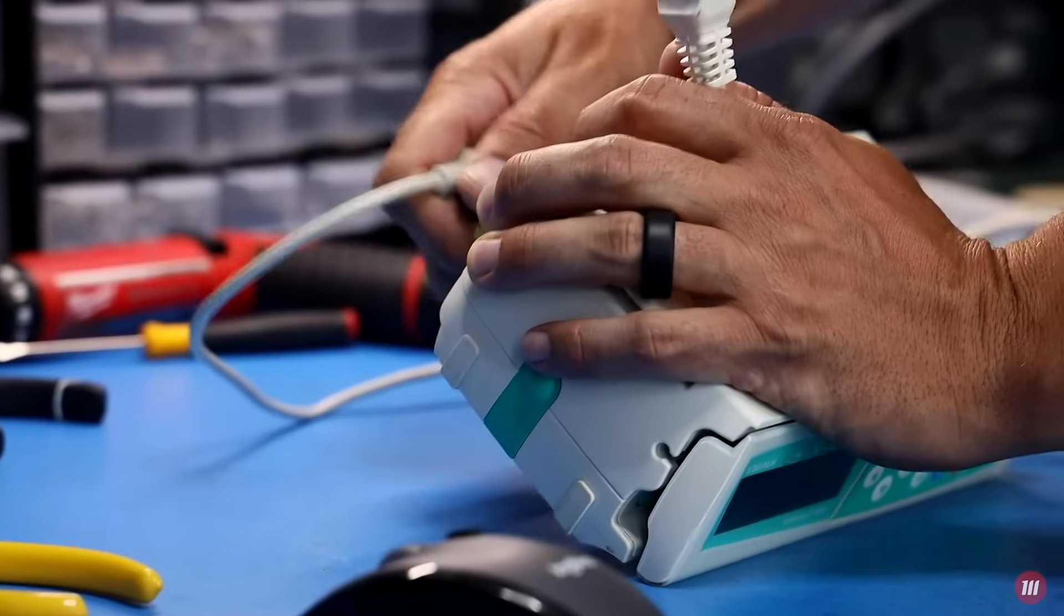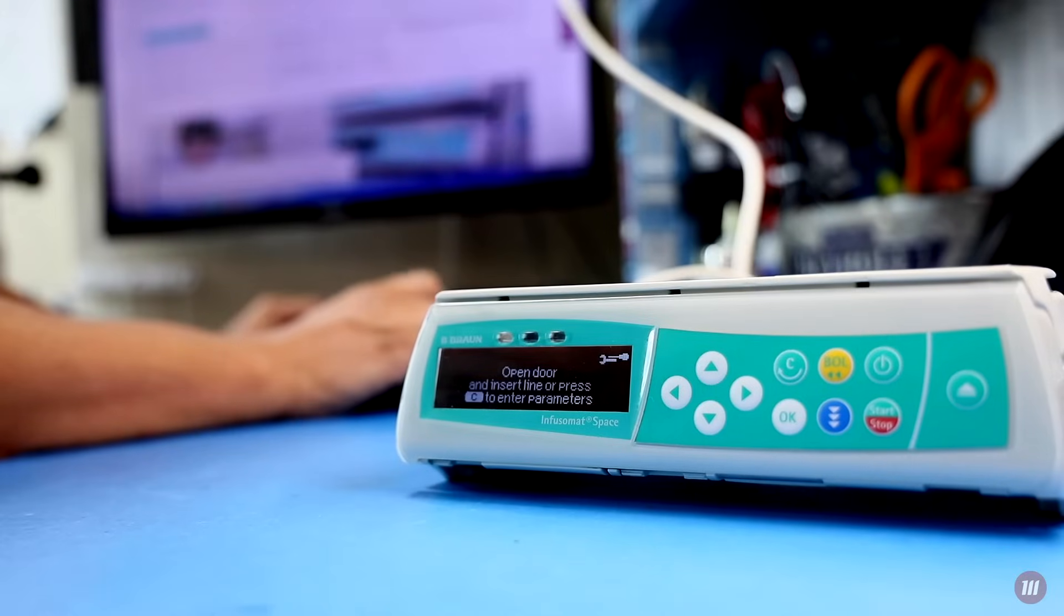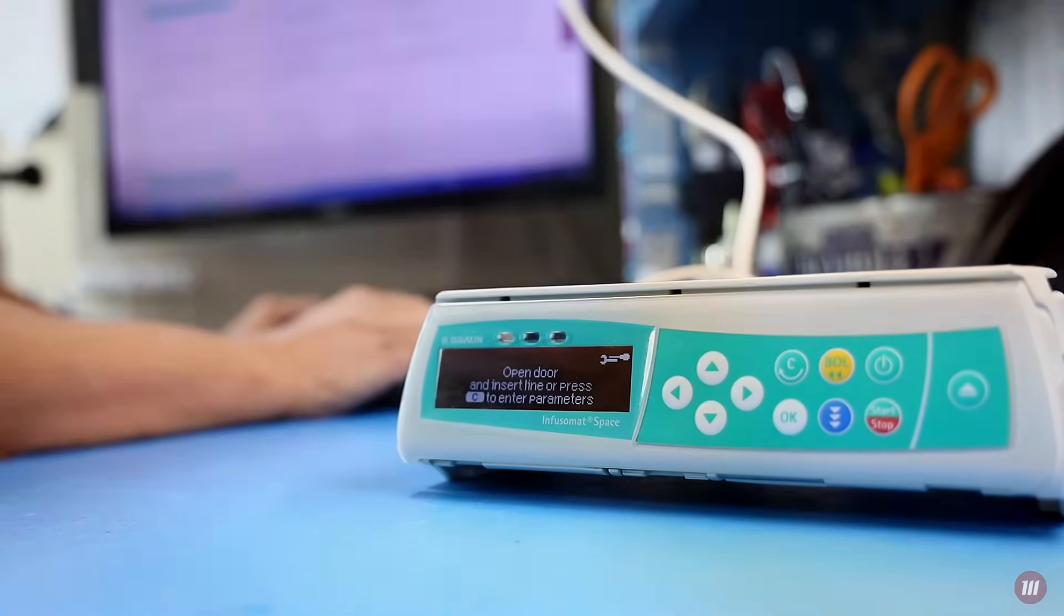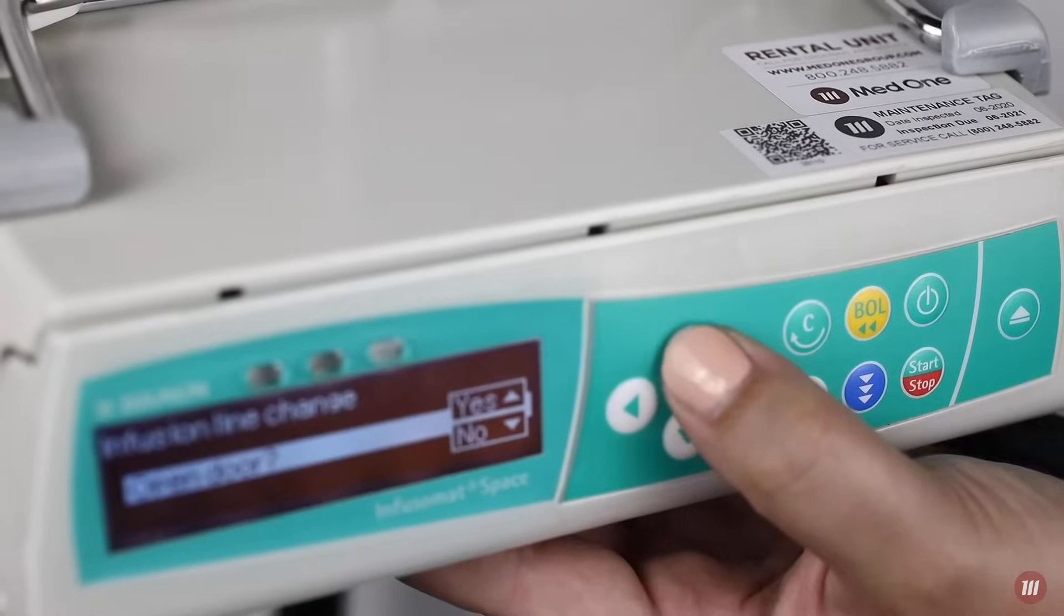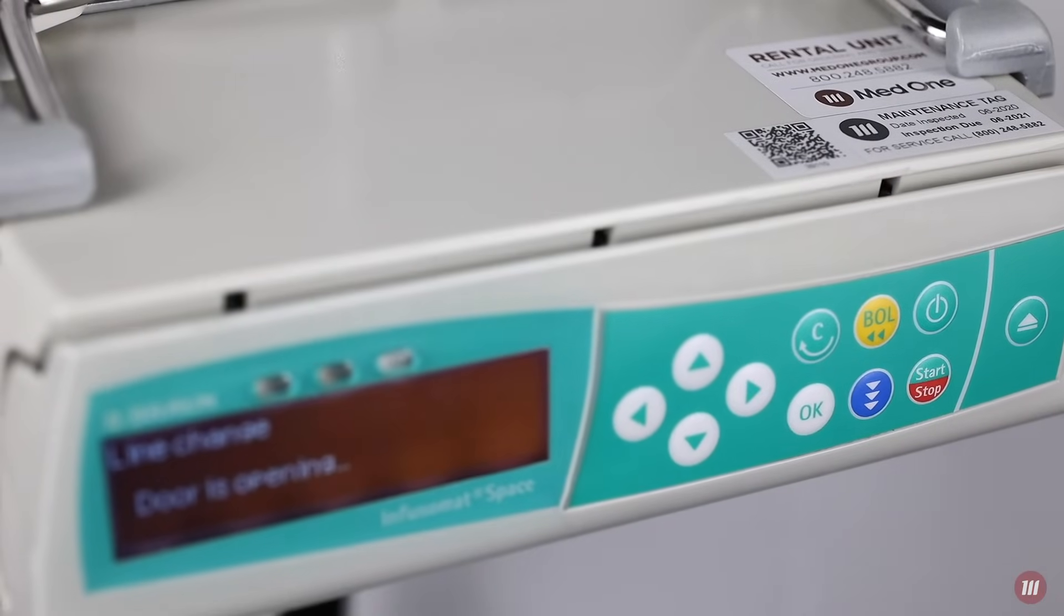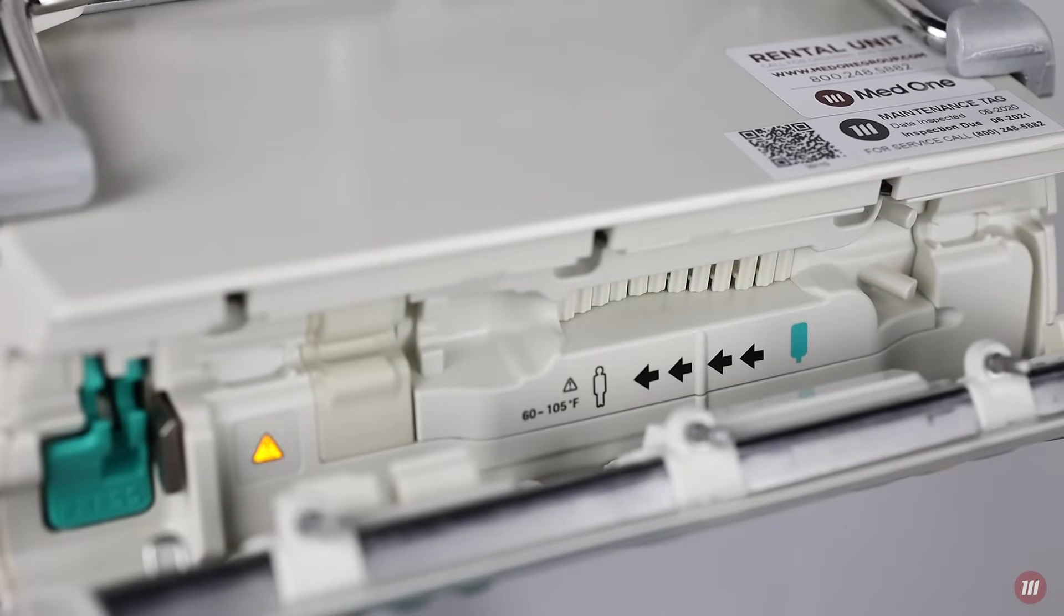The customizable drug library contains clinical advisories to promote better patient safety. Clinicians can use dedicated Bebron tubing sets when operating this IV pump. This pump features a flow rate range of 0.1 to 1200 milliliters per hour.